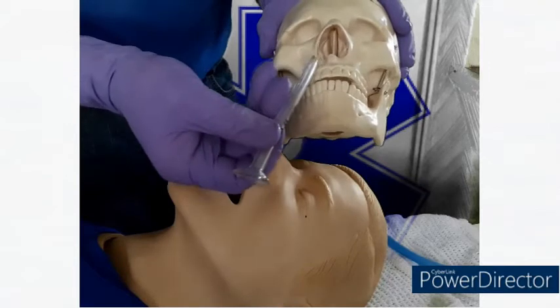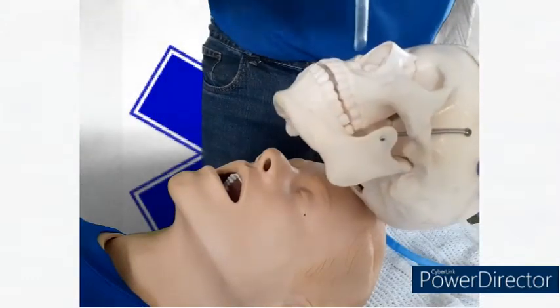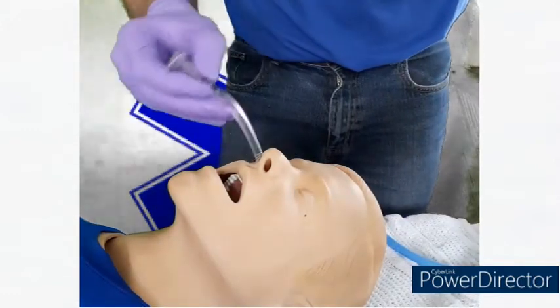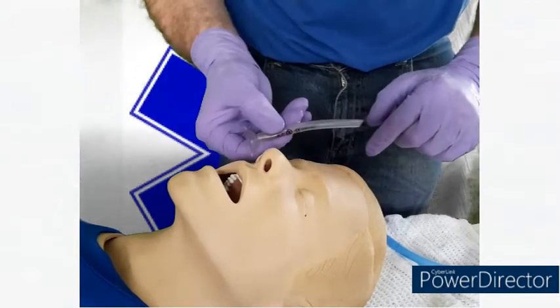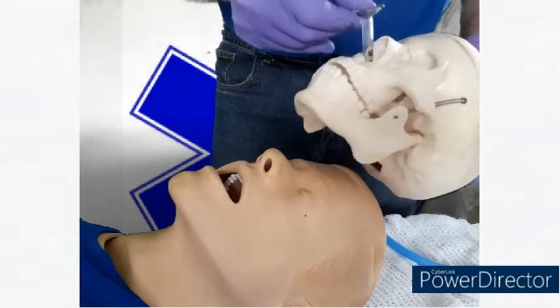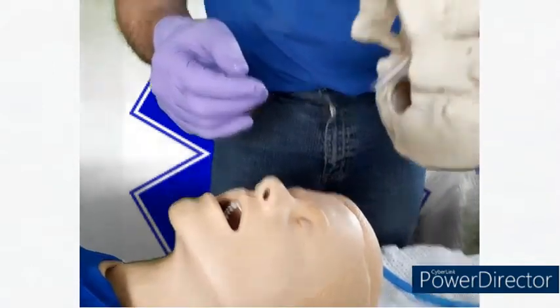What I actually want to do is, after introducing it, it comes down, so it goes straight down, because the back of this is the hard palate. So actually, when it goes in, we want to come up, so we're pushing straight down rather than going up the nostril, which may be the way that it looks like. So when it comes in, we go up and then we push it down the hard palate so that it sits round the back, comes out into that pharynx area there.